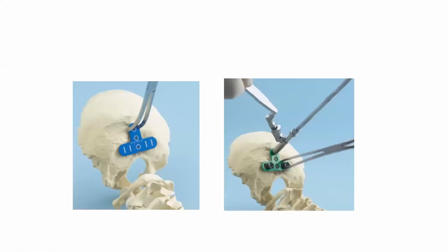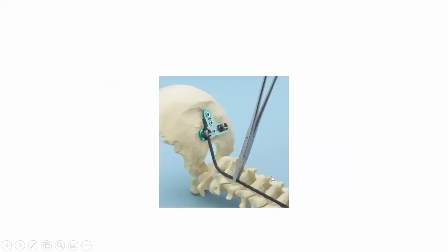So there's your occipital plate. You want to go below that nuchal line because above here is your venous sinus. There's a nice thick bone there, probably about 16 mils thick. And you put your screws in there. So it's a really strong occiput. There are also a lot of thick muscles attaching here, so you can't feel the plate. And it gives you really strong fixation to the skull. And you can just connect that onto your rods, onto your cervical spine. So you may want to have a C2 pedicle screw, and you can connect. So basically, it's connecting your skull to your cervical spine. That's occipito-cervical fixation.